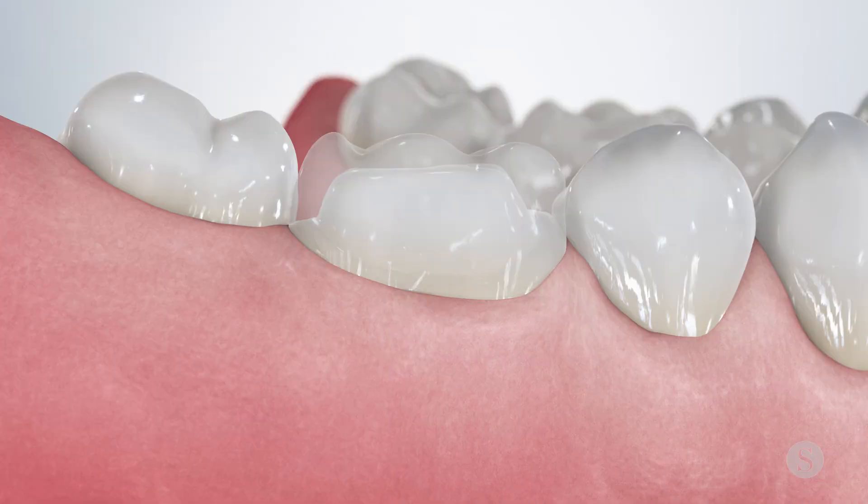Every time a crown is fabricated in a dental lab, there can still be some minor discrepancies, especially if the preparation or impressions are not perfect. That's why adjusting a crown high in occlusion could be relatively common during a crown seating appointment.